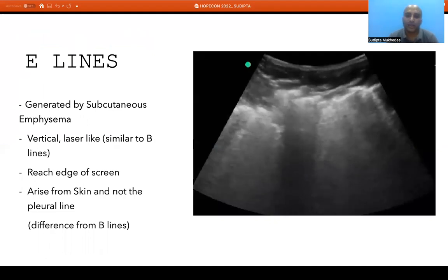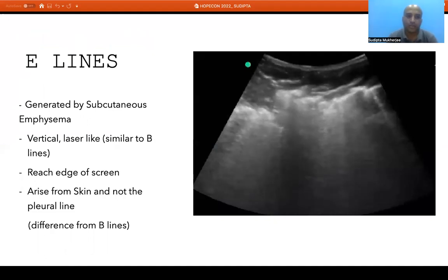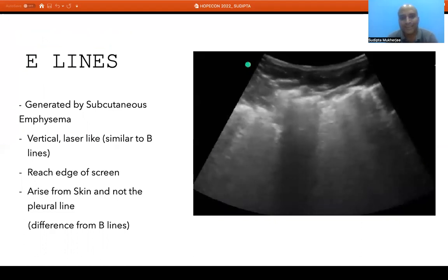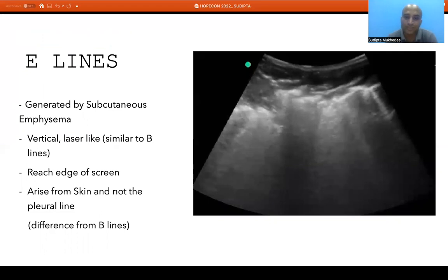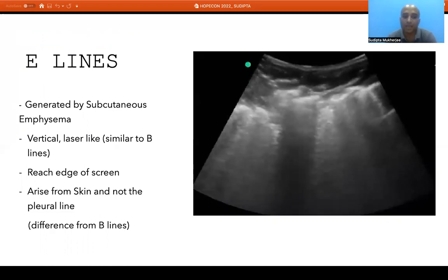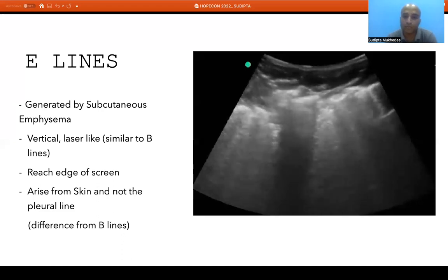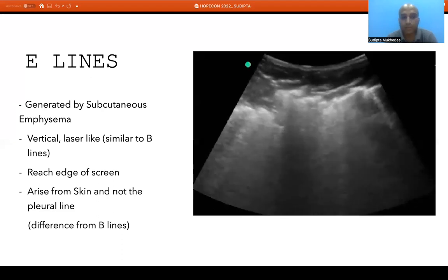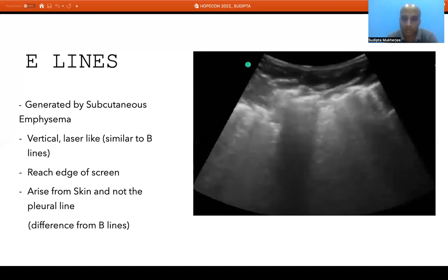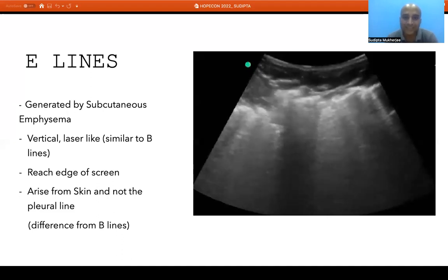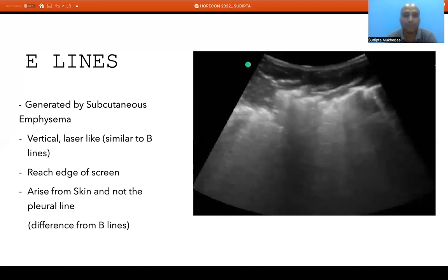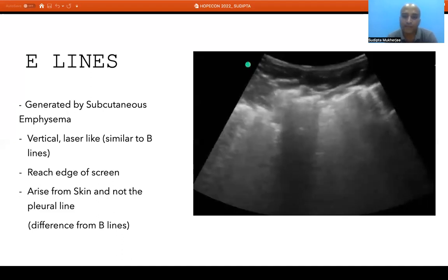If the pneumothorax extends into subcutaneous tissue — subcutaneous emphysema — we will see E lines: vertical laser-like lines similar to B lines but starting from the skin rather than the pleural line, extending to the edge of the screen. The difference between E lines and B lines is that B lines start from the pleural line and E lines start from the skin. Once we identify E lines, we cannot use ultrasound to assess deeper structures, because everything below the air-skin interface is artifact.